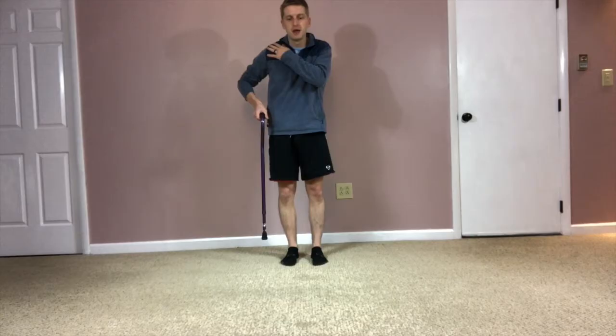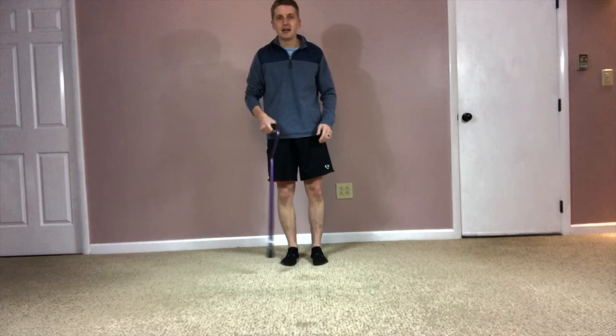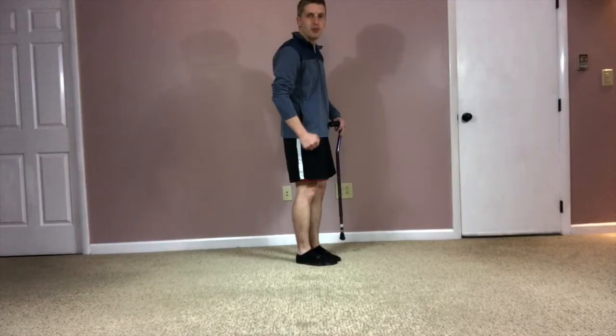If it's too high, it's going to make you have this chicken wing and it might hurt your shoulder some. If it's too low, you're going to start leaning and walking with a lean to the side. So this is a good height. You want about 20 degrees of bend in your elbow when you're holding the cane.